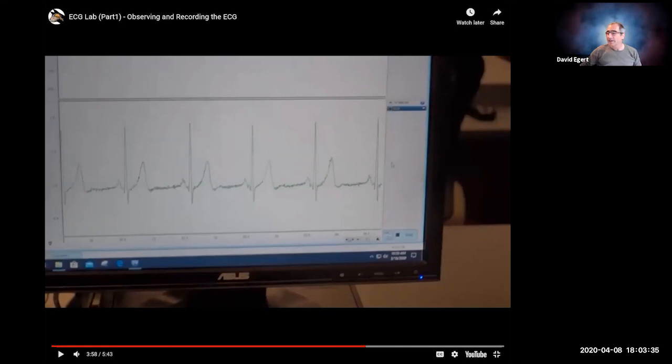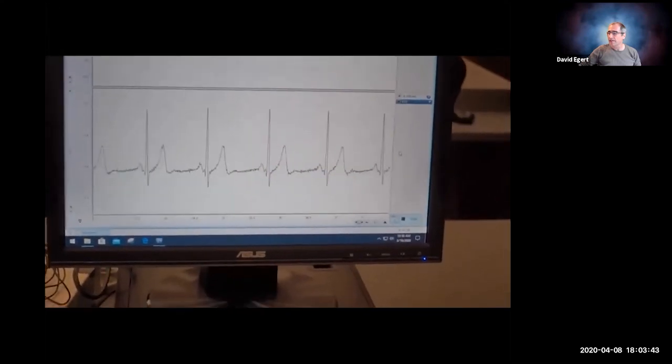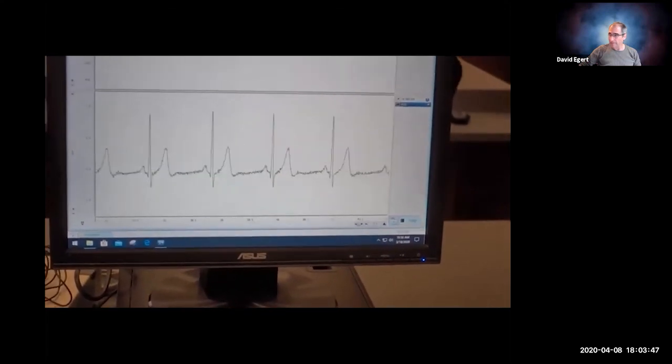So let's see what happens when Tina starts clenching her fist here. We'll keep it at 5 to 1. Yeah, I think 5 to 1 is good. All right, so it looks like our subject is healthy.